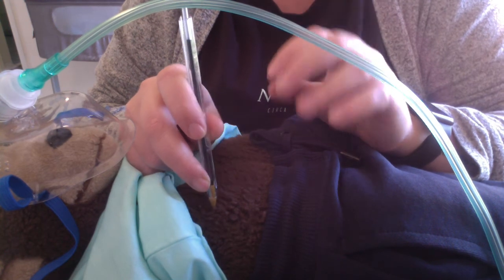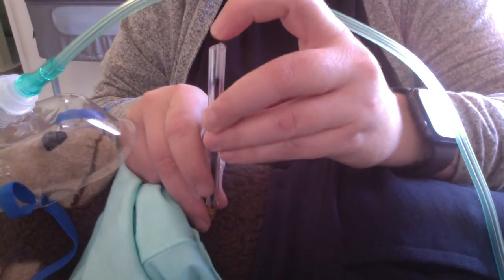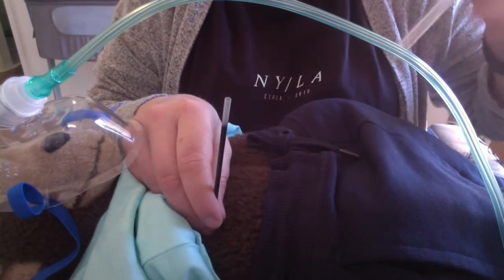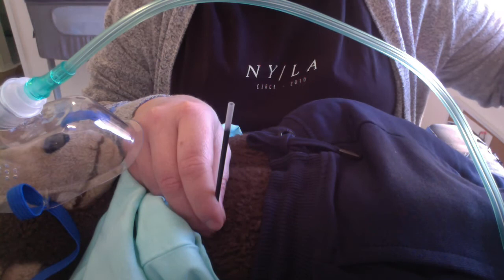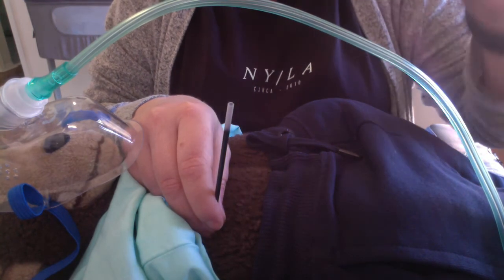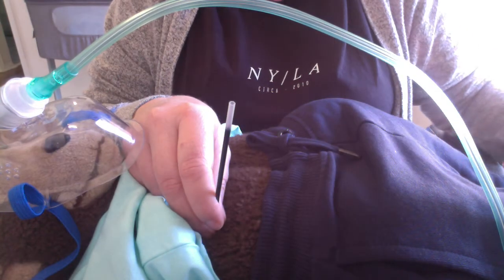You want to insert it until you feel a pop, or hiss, either one, and then you want to slide the cannula off the needle and place the needle in the sharps container.